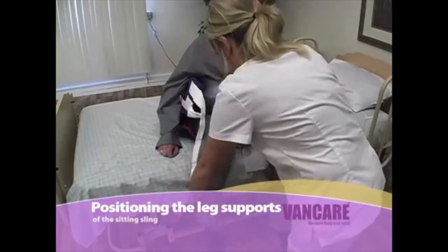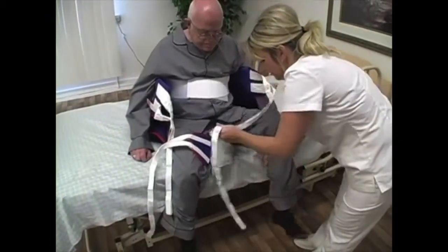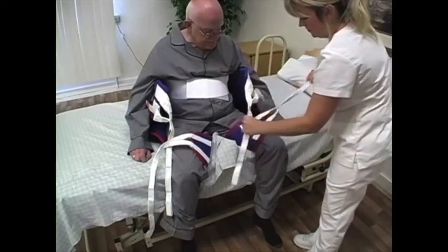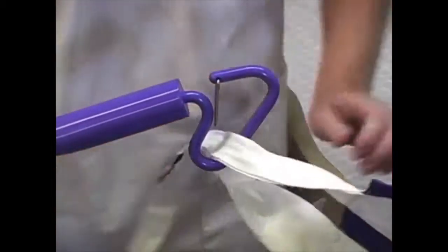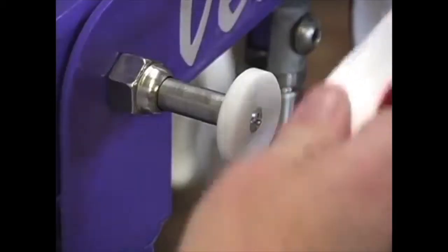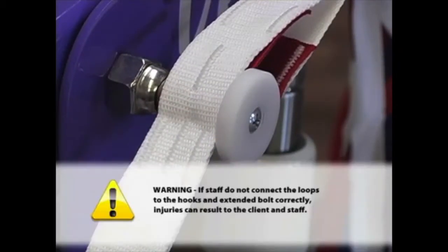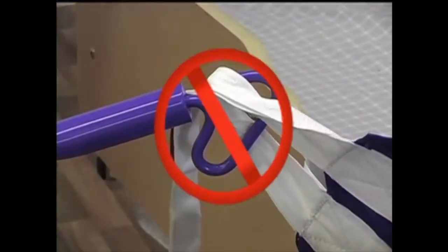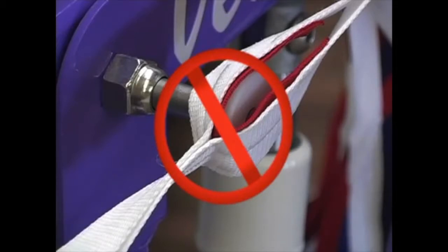Positioning the leg supports of the sitting sling: Position the leg supports by lifting the client's legs one at a time and pulling the leg supports under each leg, being sure not to twist or fold the leg supports. Connecting the back belt and sitting sling to the lift: It is important for staff to attach the back belt and sitting sling loops to the lift arm hooks with the loops on the bottom of the hooks as shown. The sitting sling leg support loops should be securely attached to the extended bolt on the mast as shown. Warning: If staff do not connect the loops to the hooks and extended bolt correctly, injuries can result to the client and staff. It is important for staff to double check the loop attachment to the lift before every transfer.